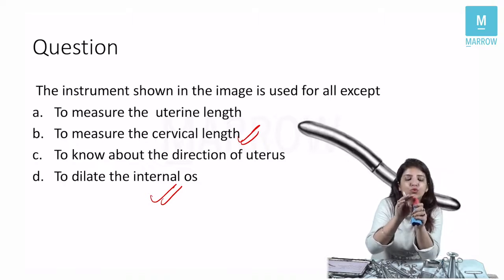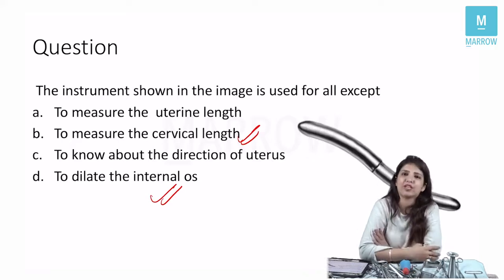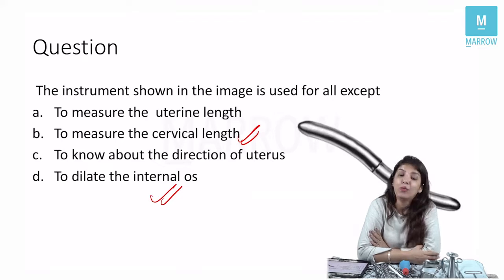Now, one more use of the dilator. Can anyone think and tell one another use of dilator? One very important use of a dilator, which I forgot to mention in the previous slide, is if you have to diagnose cervical incompetence in a non-pregnant female.